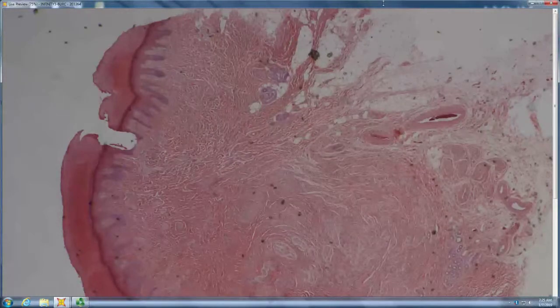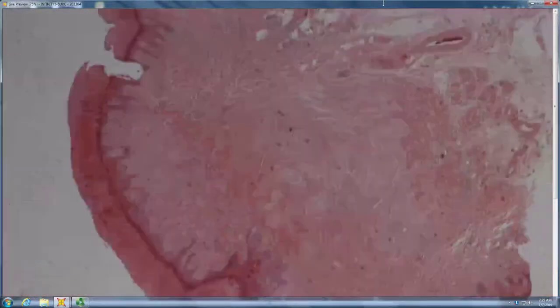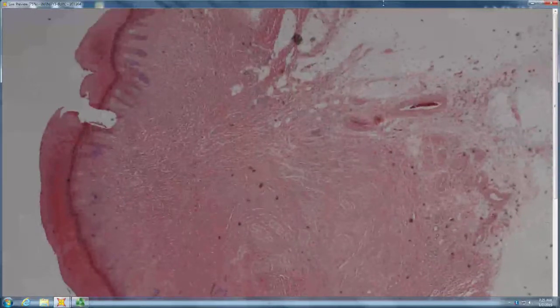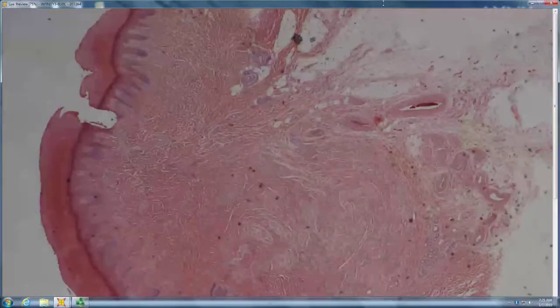Yeah, supernumerary digit, a nidget. It's a nidget, right? So supernumerary digit looks sort of like an acquired digital fibrokeratoma, except that it has nerve and vessel in it. Okay. Well done. Let's get that guy.